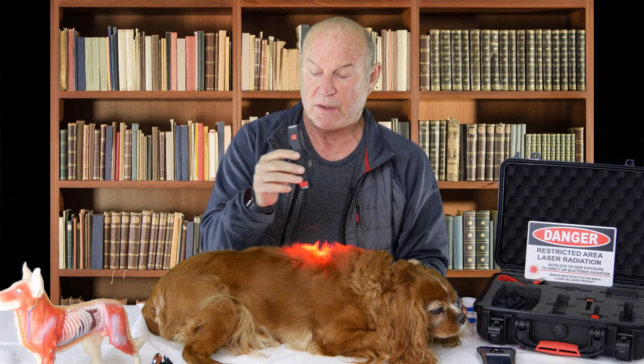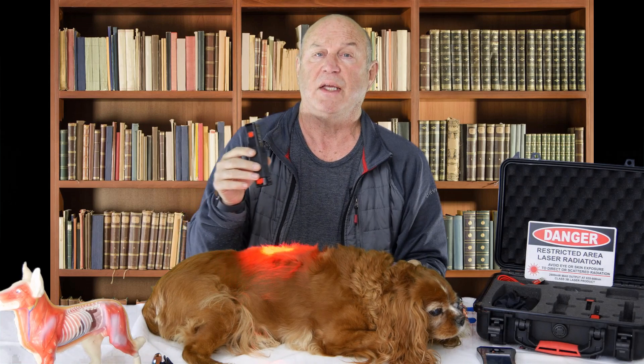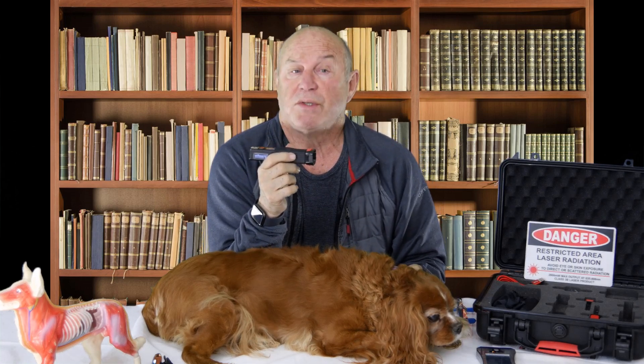The frequency response — and actually the response these animals have had — is significant, based on the fact that we're delivering all frequencies at the same time. As you can see, it turns off because I have it set to turn off at 2 minutes. This laser has just become available and we're still in the launch phase. If you get to the end of this series without unsubscribing, you'll get an offer for this device at a reduced rate before it goes up to its normal rate at the end of the series.